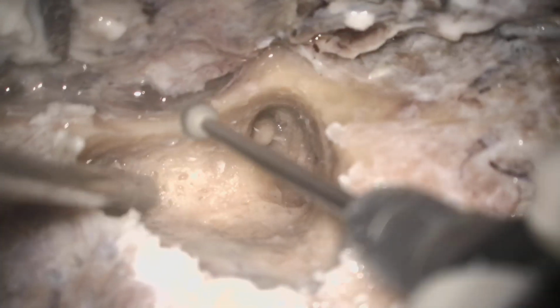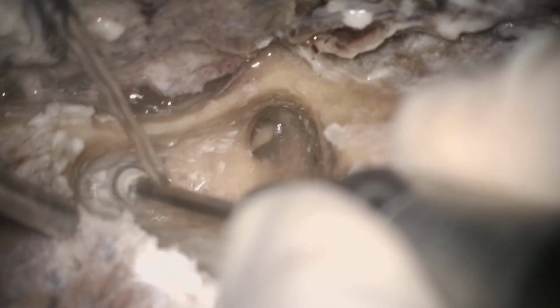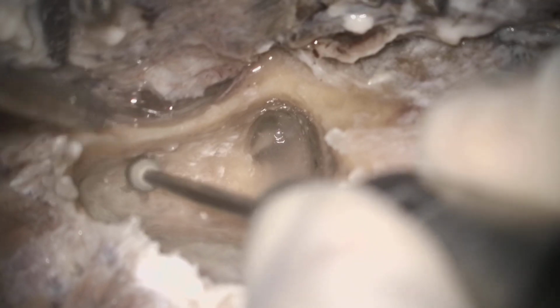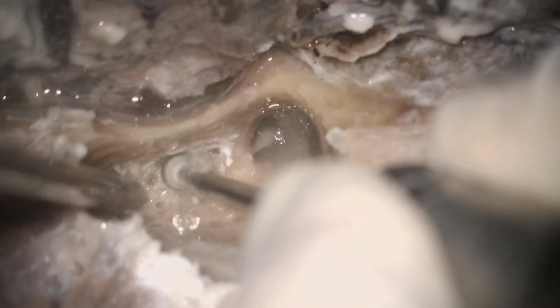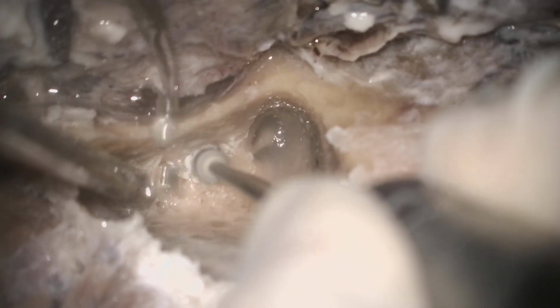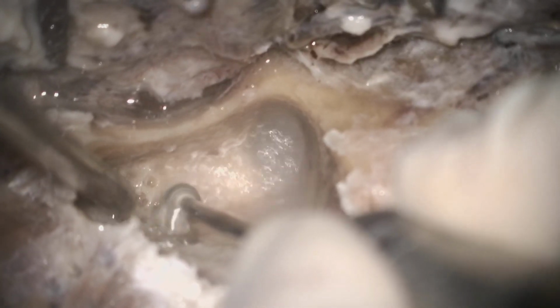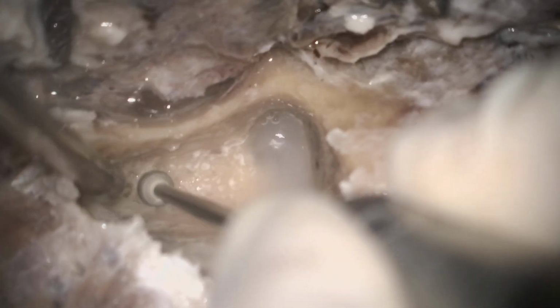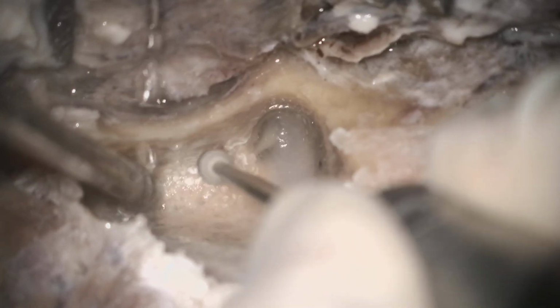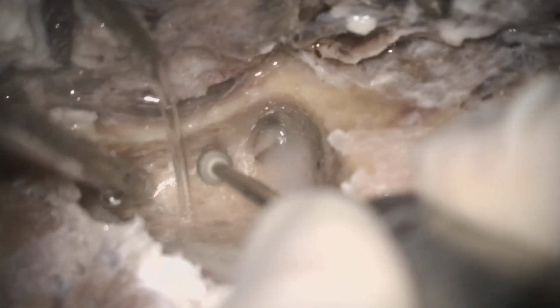But in live surgery we rarely depend on the facial nerve nowadays, because in live surgery if you try to delineate the facial nerve, there will be some chance of damage by thermal injury, especially in the pediatric age group, because the bone is very thin. So for that reason we always use the anatomical coordinates to delineate the posterior tympanotomy site. And in some cases we actually define the chorda tympani in the anterior part and in the posterior part the facial recess, the facial nerve also. So this is how we are drilling.